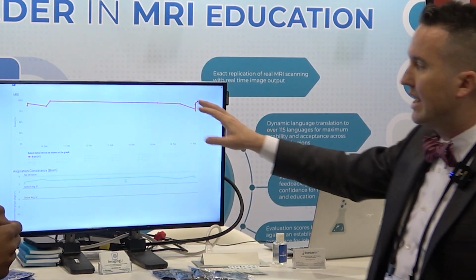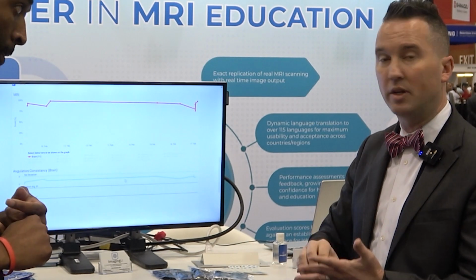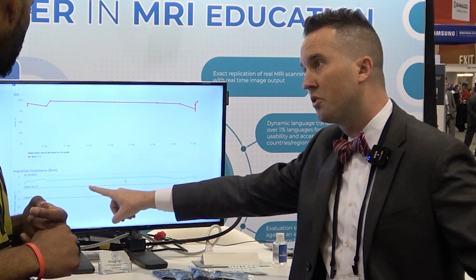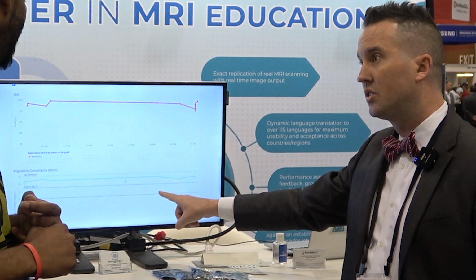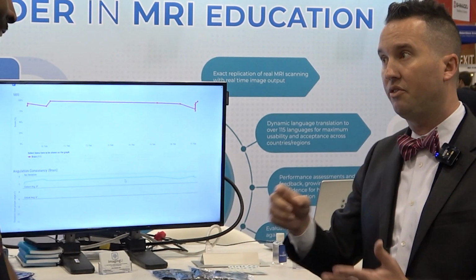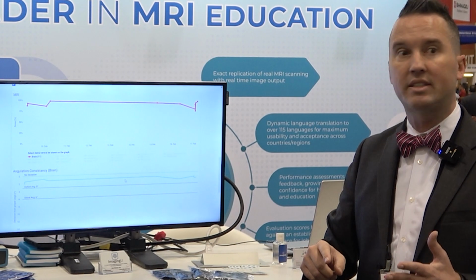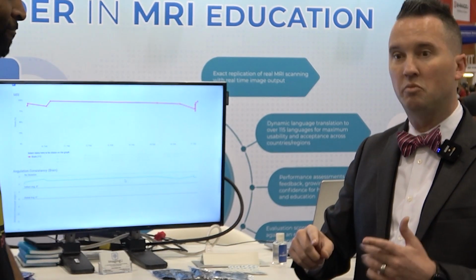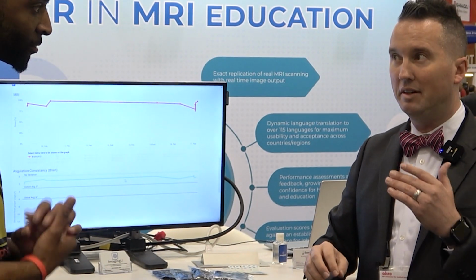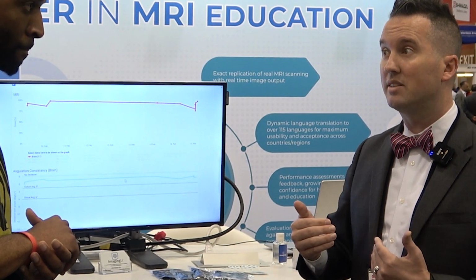We can actually tell you, inside of a brain, let's say I've given you the same brain 3 or 4 times, how much do you deviate angle-wise from yourself? And then we can cross-reference that for every person at your hospital. So if you and me and Katie and Robert are all going to scan the same patient, like a seizure patient, and that patient comes back for 3 or 4 time points, how consistent are we scanning by ourselves, and how consistently are we scanning to each other?